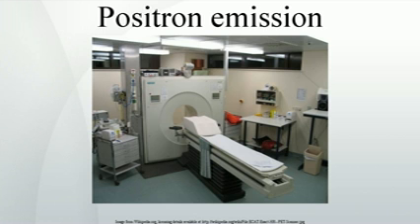Coincidence events can be grouped into projection images, called sinograms. The sinograms are sorted by the angle of each view and tilt, for 3D images. The sinogram images are analogous to the projections captured by computed tomography, CT, scanners, and can be reconstructed in a similar way. However, the statistics of the data are much worse than those obtained through transmission tomography. A normal PET dataset has millions of counts for the whole acquisition, while the CT can reach a few billion counts. As such, PET data suffer from scatter and random events much more dramatically than CT data does.